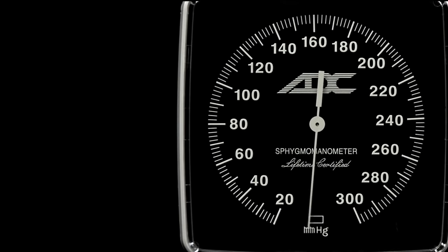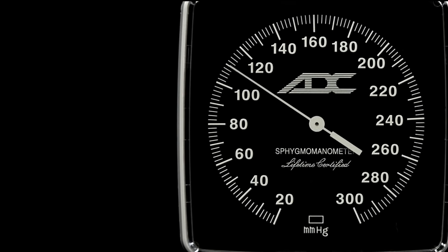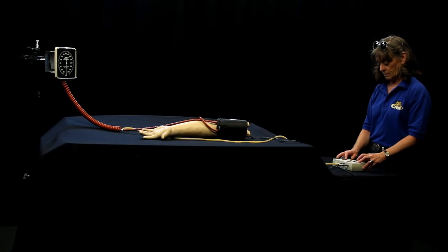Now let's look at the markings as the needle goes down the gauge. Let's start at 150. What number is the needle pointing to now? It's indicating 138. Now the needle is pointing at 110. Where is the needle pointing now? It is indicating 68.